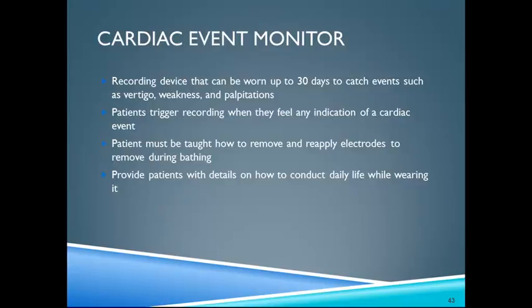And patients should be provided with details on how to conduct daily life while wearing it. You want them to go about their way. You don't want them to just sit around and wait for the event to happen. These types of monitors are often called memory loop recorders or King of Hearts to most cardiologists and physicians.